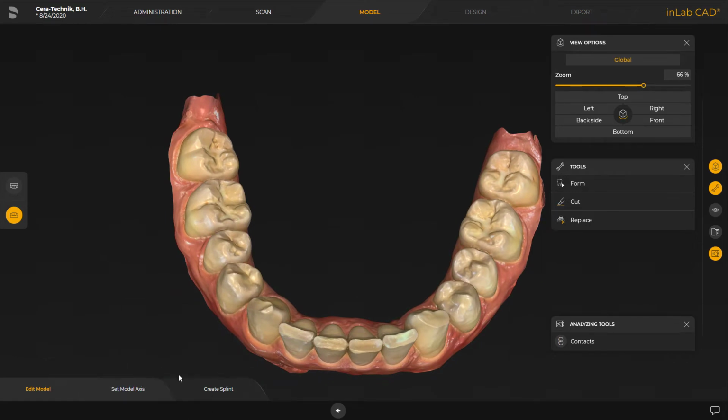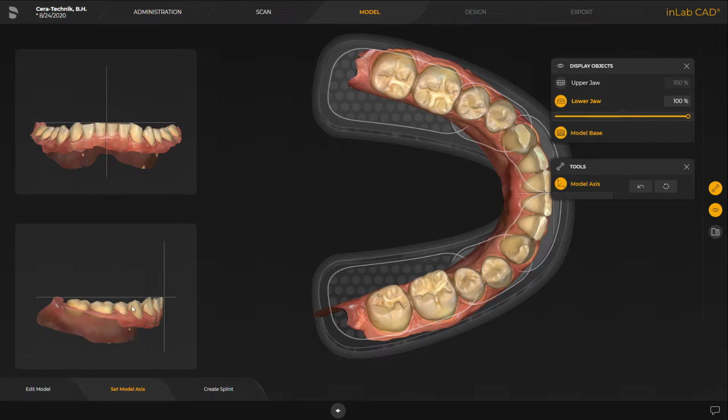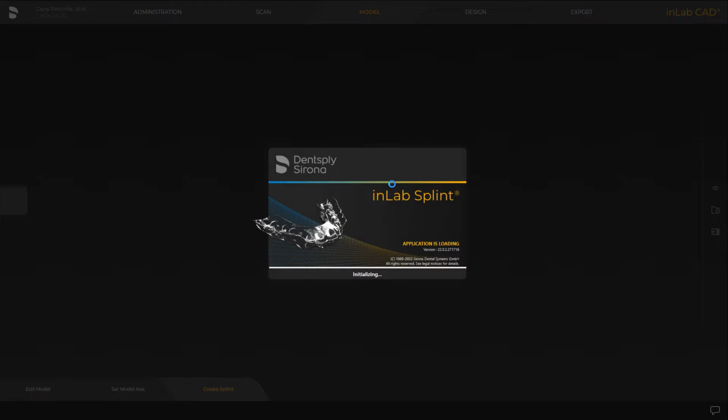Next step would be setting up the model axis. So in this case, we have the reference of the lower jaw, and we set the axis according to all three pictures here, an axis. That makes it easier later on for the virtual articulator to get the proper occlusal bite. And to get into the inLab Splint app, we just click on Create Splint and the app will automatically start.